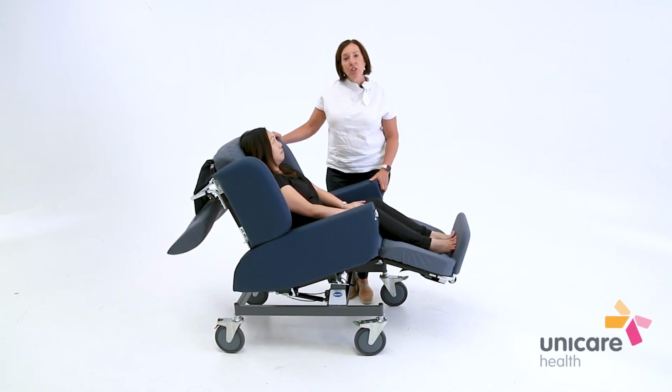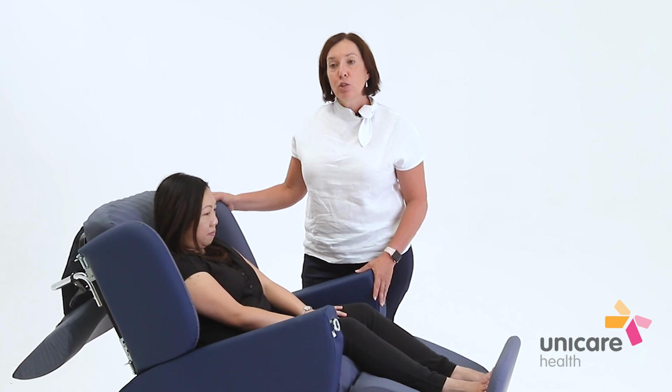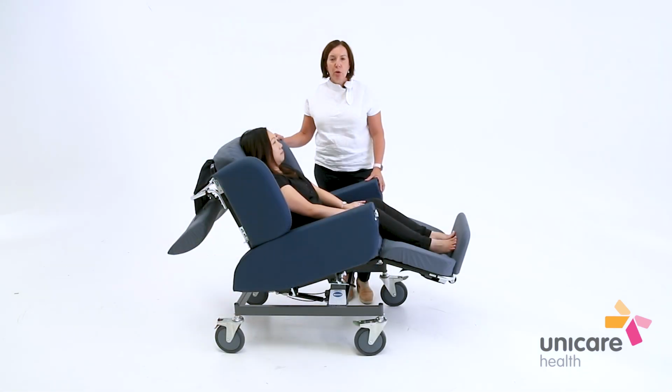The Regency Care Chair is covered in a vapour permeable Dartex material in the central seated area and leg rest. Heavy duty vinyl on the armrests and backrest wings. It's recommended that these covers are wiped down regularly with soap and water or antibacterial wipes. This should also include opening the wings and armrests to remove any built-up food and debris.